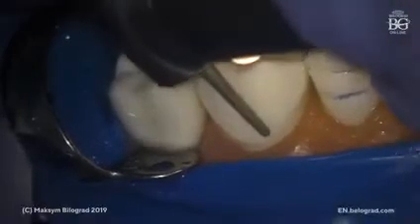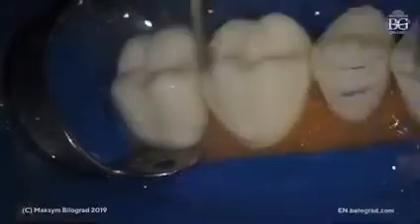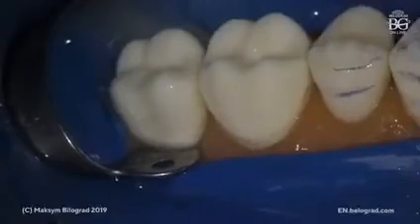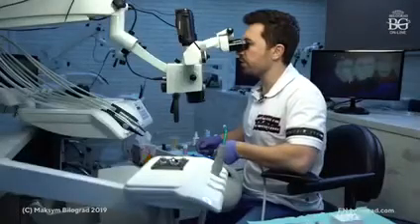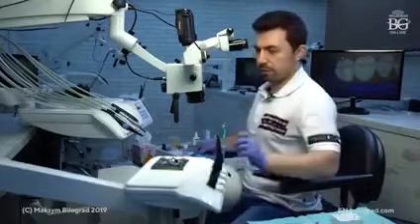We have already made the initial finish line from buccal, and now we move and turn our burr to the mesial aspect of the tooth, making the initial finish line here. We have to move a little bit more to mesial, because we don't want to see the transition. We would like to mask the transition here. So the first stage of window prep is done. Okay, it's done. Pretty nice.